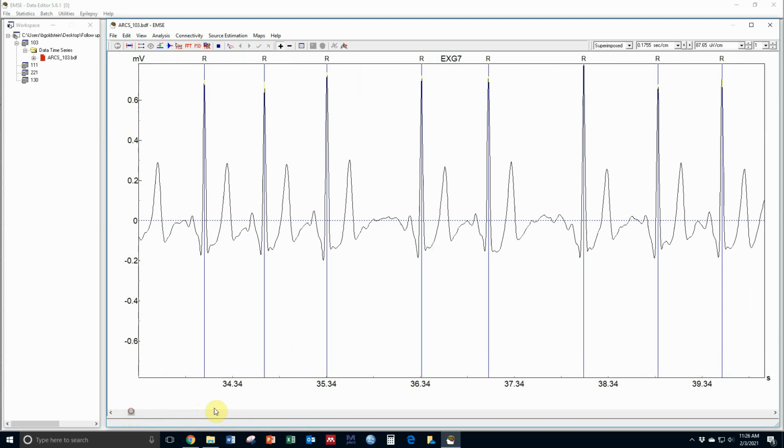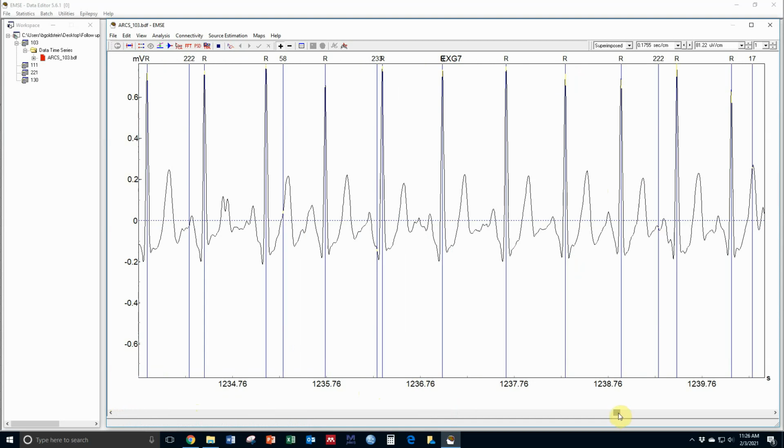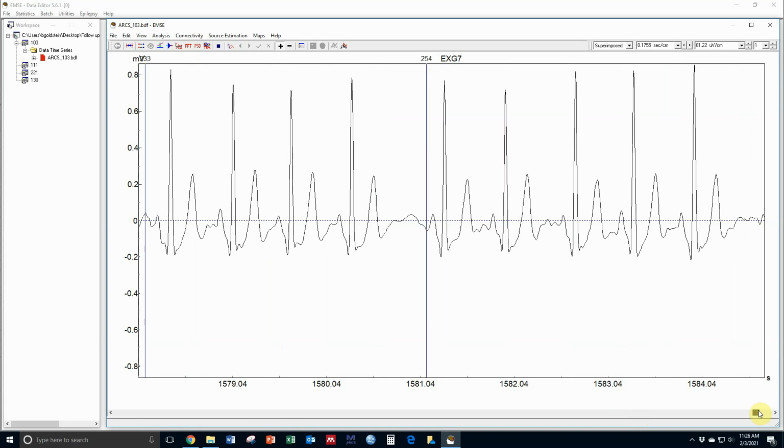And we'll look towards the end just because I don't want to take up too much time. So again, even here, this is a good point to show, which is that these two R's are a little bit further away from each other than is typical for this person, but it doesn't matter. It's not capturing the T's by accident. Sometimes it takes the program half a minute to put the R's on there, but they're there even if they don't pop up right away.